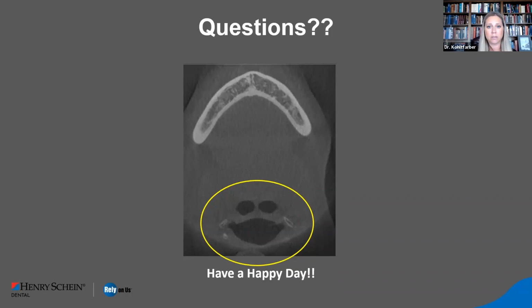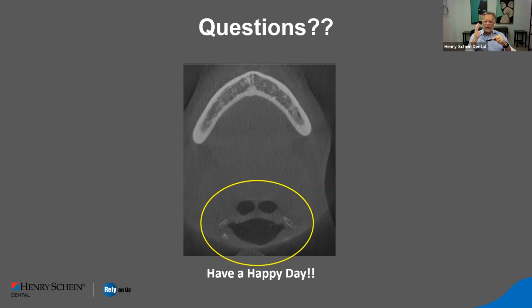You're right that medical doses are going to be way, way more than dental doses. Certainly our CBCTs are way less dose than a medical CT is going to be, but there's so many of us and we take so many collectively as a group that is the inherent issue. Does it have anything to do with the placement and the organs or the area of the head?